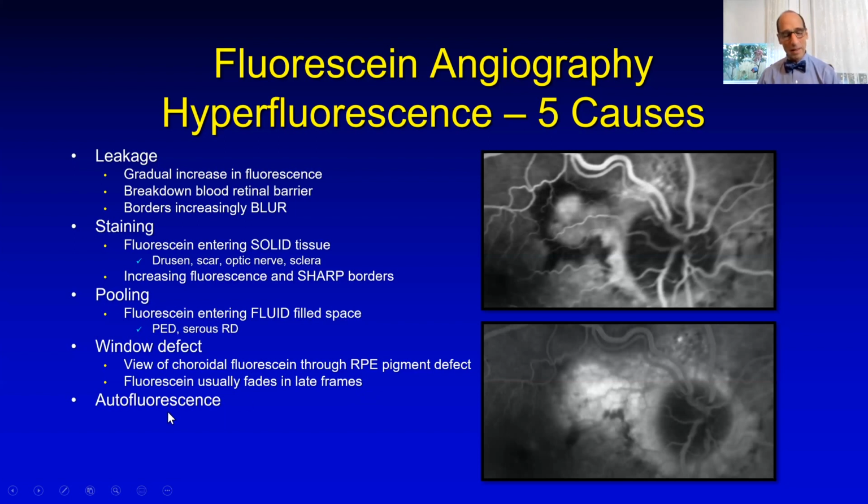And then the weird thing about today's images, and this is not true when I was younger, is you also do see autofluorescence in your fluoresceins because the images are so high resolution. So anything you see on autofluorescence, you'll see on the fluorescein angiogram. We'll talk about that more in conference. It gets a little confusing because some of it has to do with your signal. When your fluorescein's very bright, you really don't see much in the way of autofluorescence. So at your peak phase, you're not going to see autofluorescence, but early in the angiogram, you'll see autofluorescence the first couple of seconds, and then very late, sometimes you'll see things that are autofluorescing. The rest of the time, it's swamped out by the fluorescein.